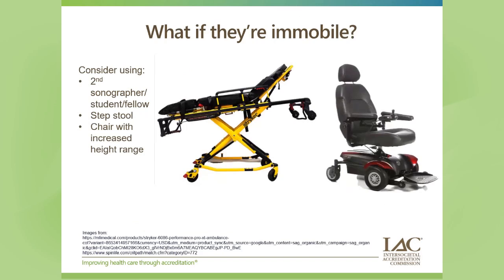Now, what if they're immobile? Because let's be honest, not everybody who comes in is going to be able to move. Maybe they roll in on one of these bed examples here, on a stretcher that is not the stretcher that you would like to work with as far as going up and down, or they're just not going to be able to get out of their mobile chair that they rolled into, or you don't have the tools to move them from that chair into the bed safely for them or for you. And so in those situations, consider what's the best mechanism for you to do this so that you can get their exam done appropriately, and you're not going to put yourself into a compromised scan position.